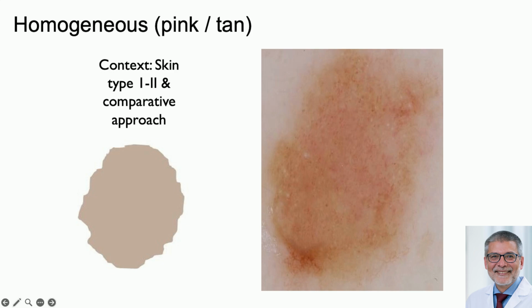Okay, what's the dilemma? You will see in my second talk that one of the anchors to the diagnosis of cancer is to look for neoangiogenic vessels. So looking for blood vessels in a lesion can help you to know when something is benign or malignant. Okay, where are blood vessels located? They're located in the papillary dermis and dermis. Okay, what allows light to penetrate through to get to that dermis level? It's going to be that you don't have eumelanin that absorbs light. So the less pigment you have, the more light will enter the papillary dermis and the dermis, and the more likely you are to see the normal vessels that we all have, right?